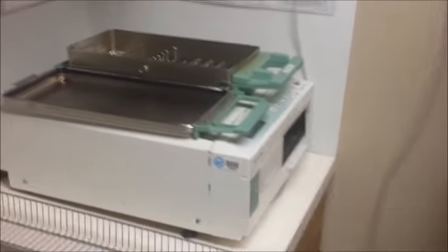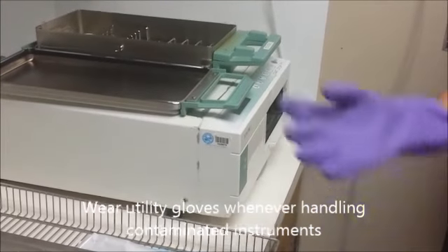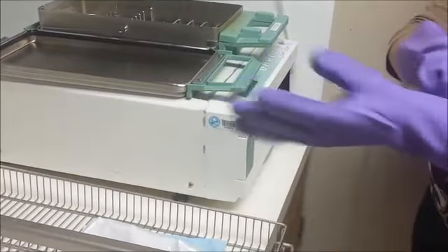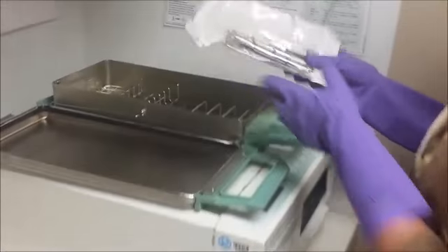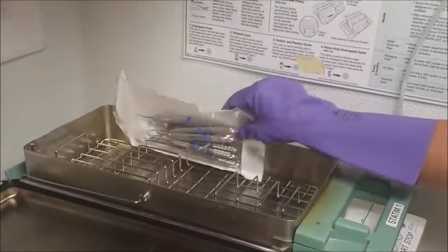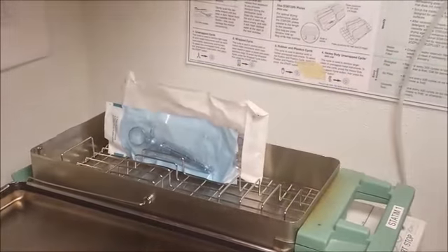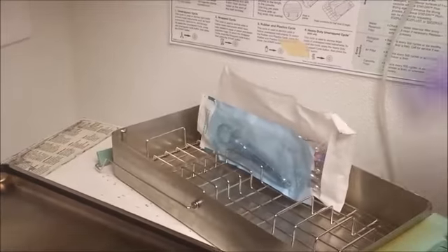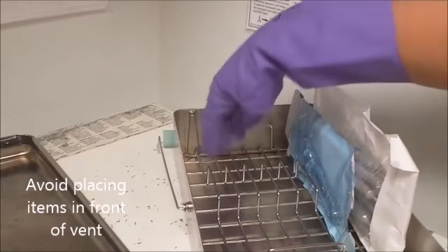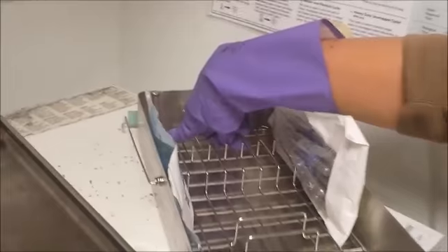Wearing eyewear and utility gloves, here's how to properly load the cassette. When you're loading the cassette, there are little slots here, and you want to place the bags vertically in those slots. Be careful — there is a vent right here in the rear, so make sure that when you're placing the bags you leave enough room to keep that vent open.